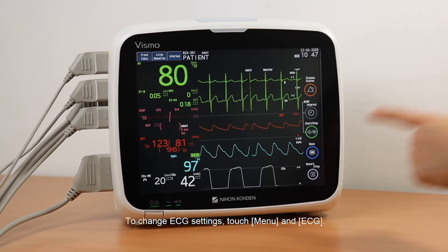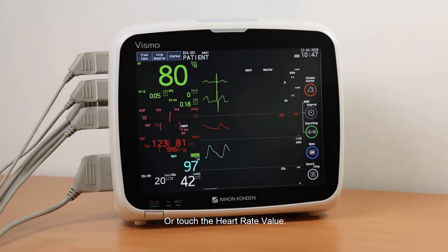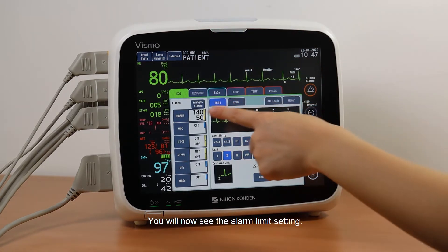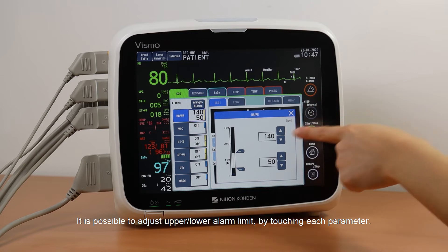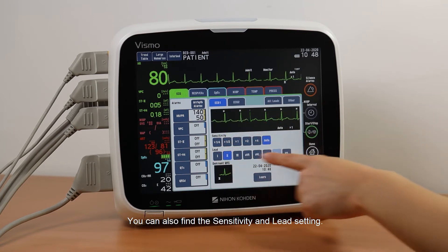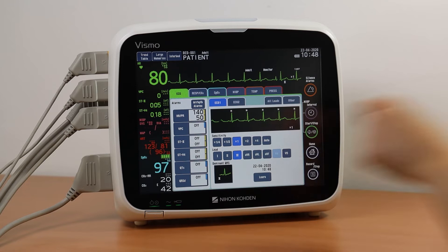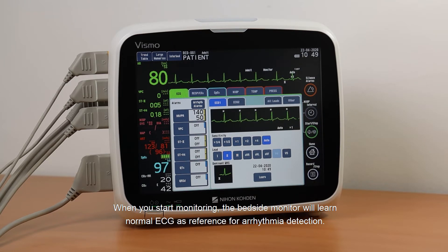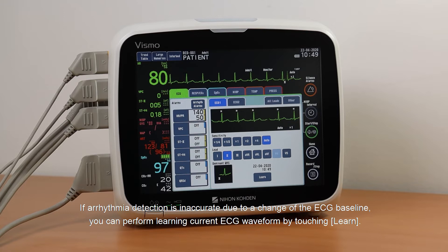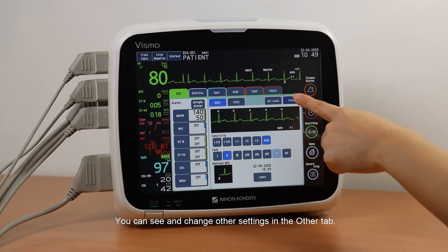To change the ECG settings, touch Menu and ECG, or touch the Heart Rate value. You will see the Alarm Limit setting. It is possible to adjust the upper and lower alarm limits by touching each parameter. You can also find Sensitivity and Lead settings. When you start monitoring, the bedside monitor will learn normal ECG as a reference for arrhythmia detection. If arrhythmia detection is inaccurate due to a change in the ECG baseline, you can perform Learning Current ECG Waveform by touching Learn. You can see and change other settings in the Other tab.